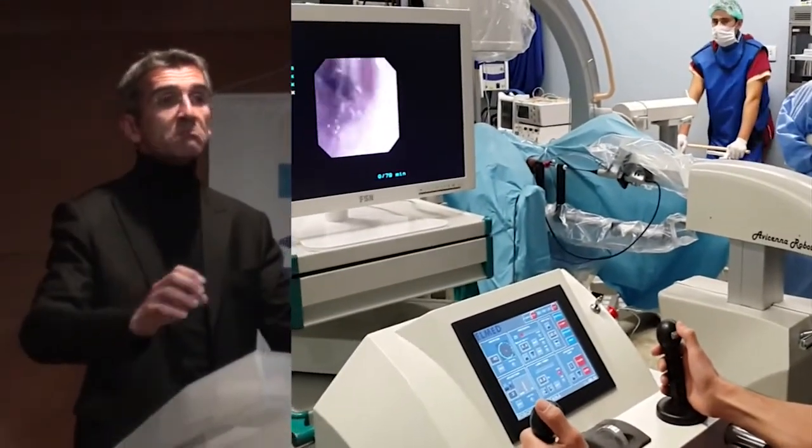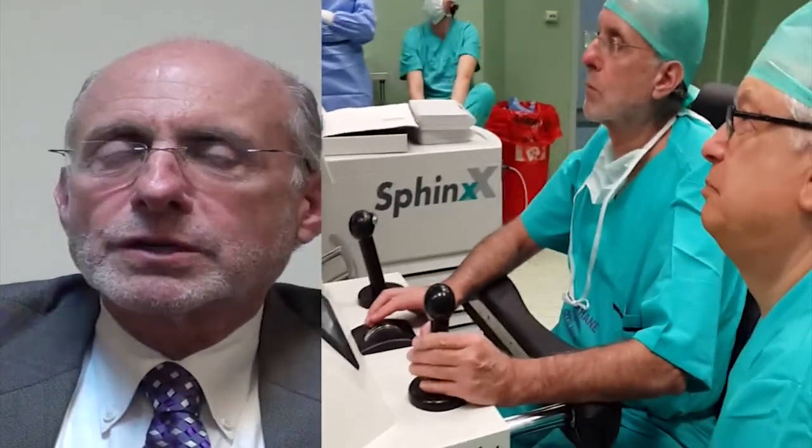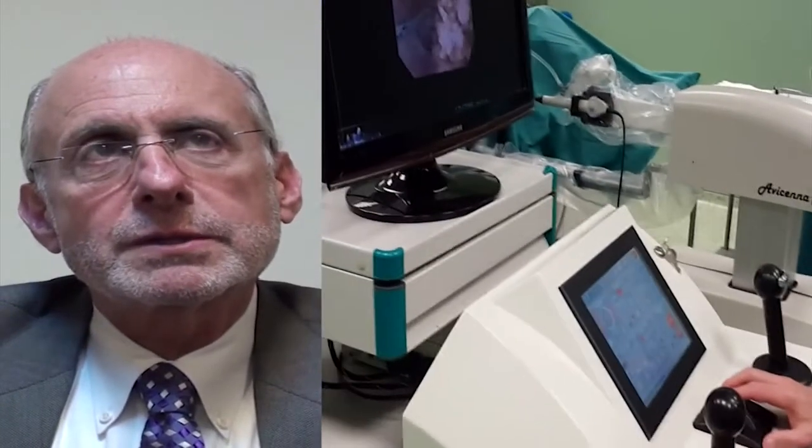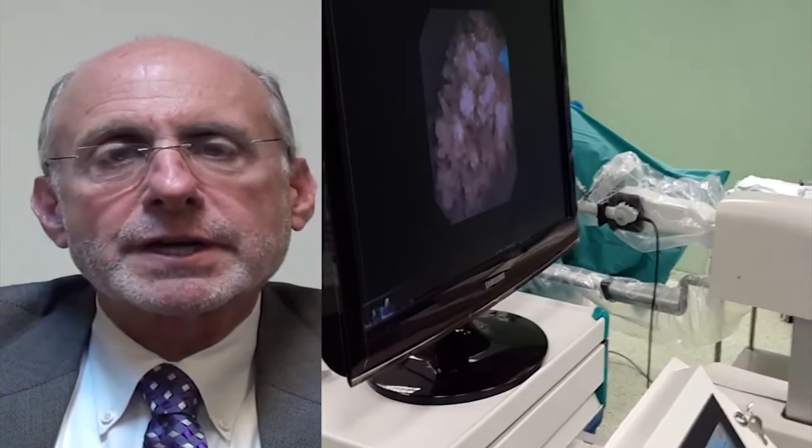To place into the robot is maybe less than two minutes. I was very impressed with the robot. It took a little bit of getting used to, but I think after three or four cases, you would feel very comfortable.